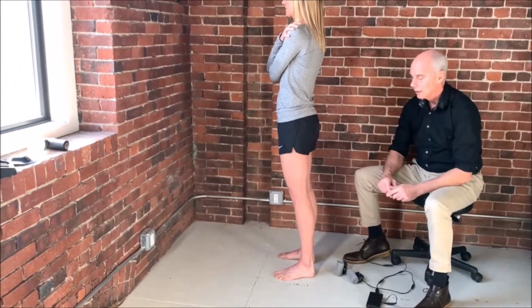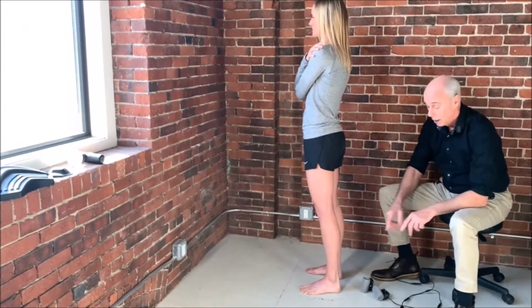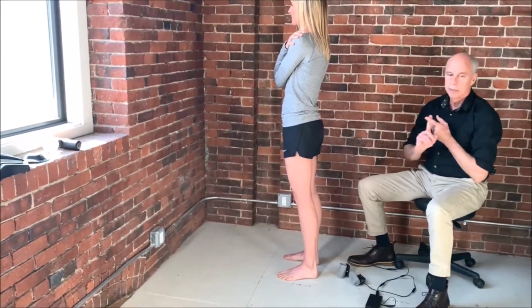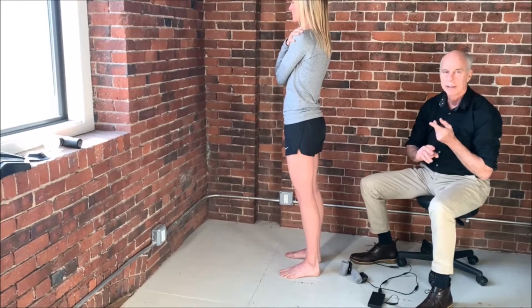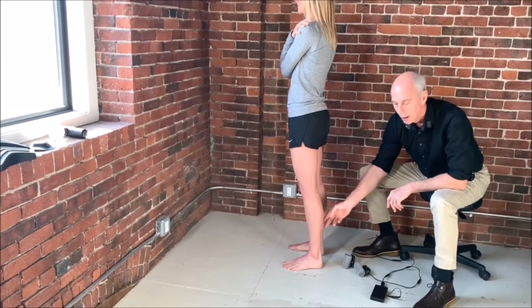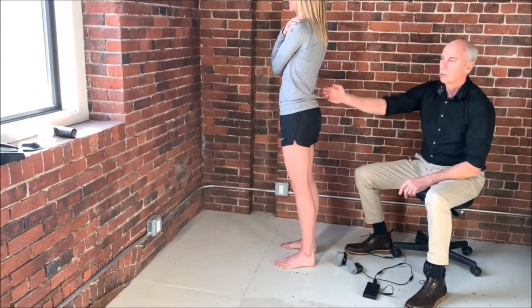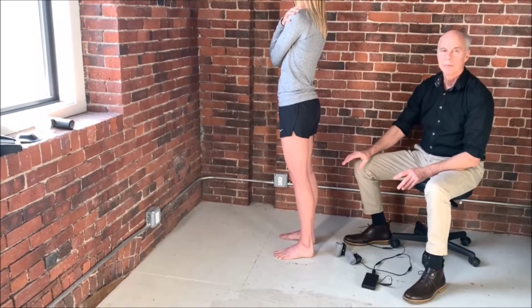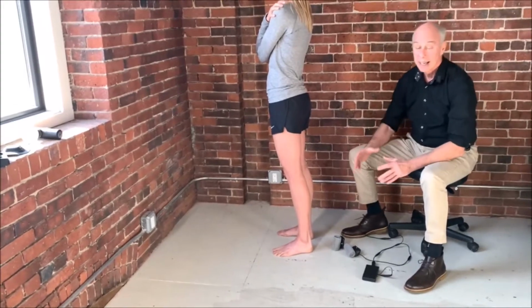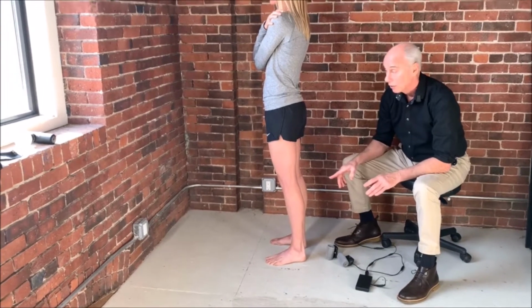But then they got funding to do an even larger study. They took asymptomatic people and did the test that I'm about to do in a second on people. They measured fear avoidance behavior, they measured posture, they measured a bunch of different things. They also measured how people swayed once these motors were placed on them, and then followed them for years. And they showed that people who had excessive posterior sway with this test were 4 times more likely to be injured within the next 2 years. So it predicts injuries. It's nice to know because it's easy to fix. You can prevent low back injuries with this 30-second test.